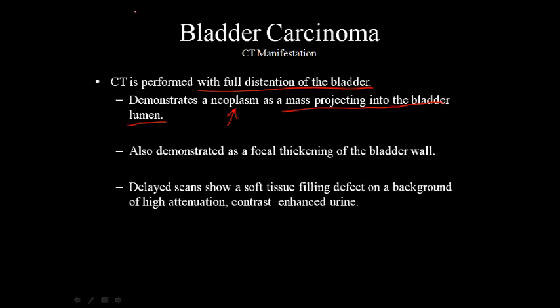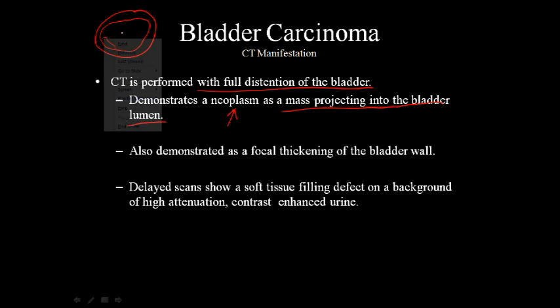And so what you're going to see is the bladder looking something like this. I realize that this is a very crude drawing. You have the bladder wall, then you're going to see something inside of it. And so if all of this is filled with contrast, you're going to see an absence of contrast in this area as something is projecting inside of the bladder.